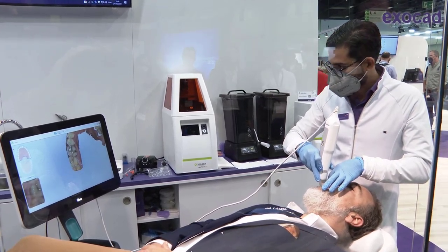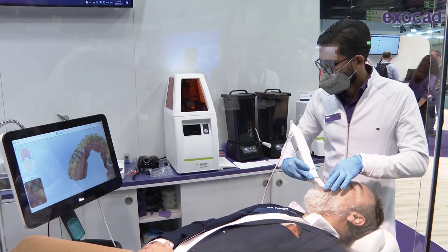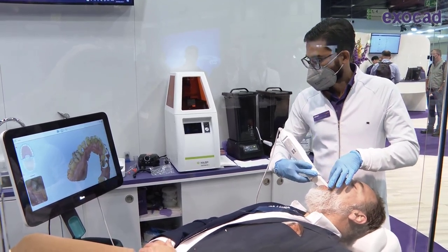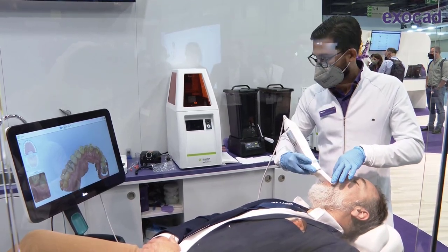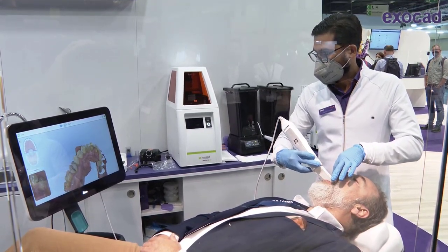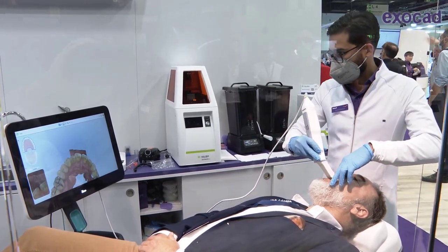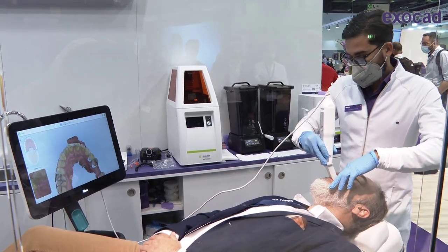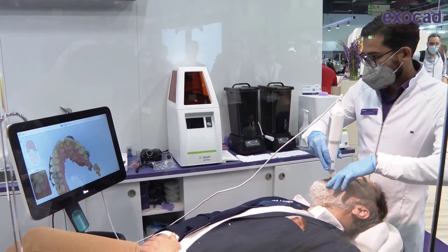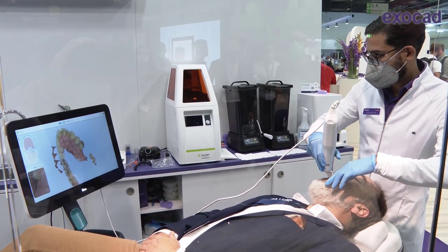On the second pass we go onto the palatal side. If you start on the lower arch you would do the lingual first. There's a little twist of the hand that helps you get to the mesial areas, and we can go to the opposite quadrant and stay on the inside. As you can see on the scanner, there are a few gaps that are being filled immediately — the AI will help you with that.